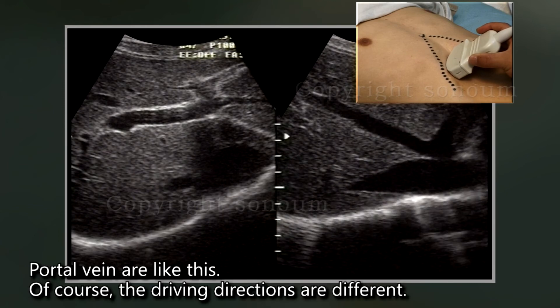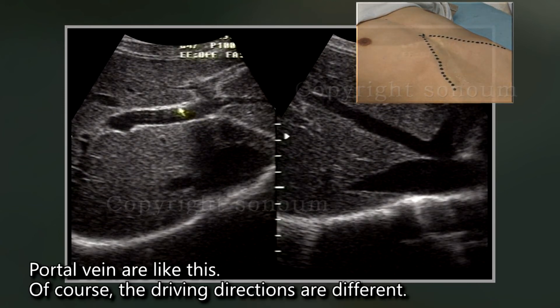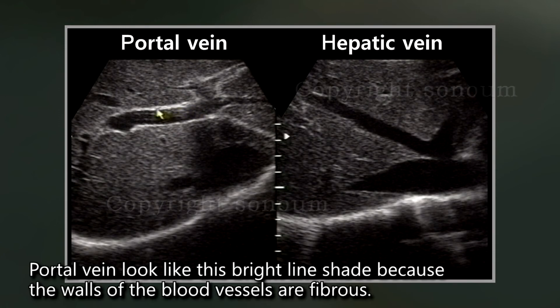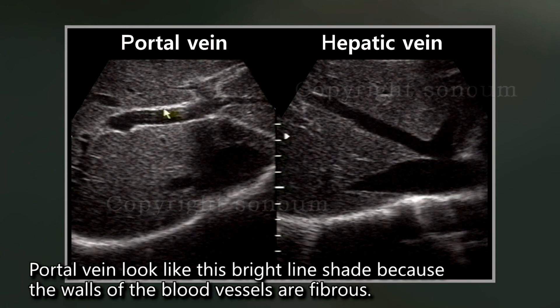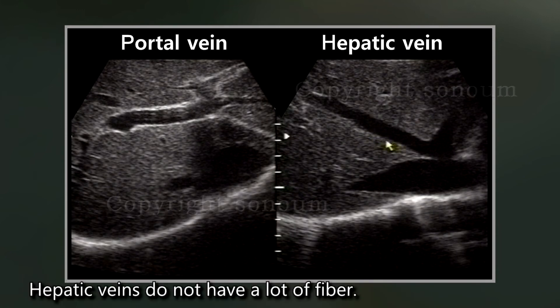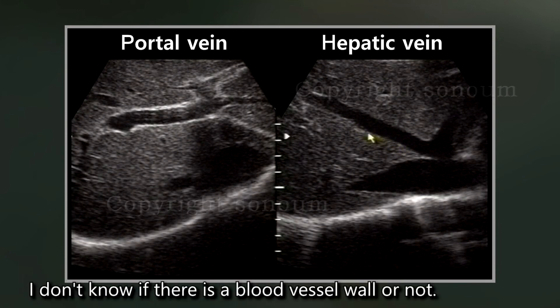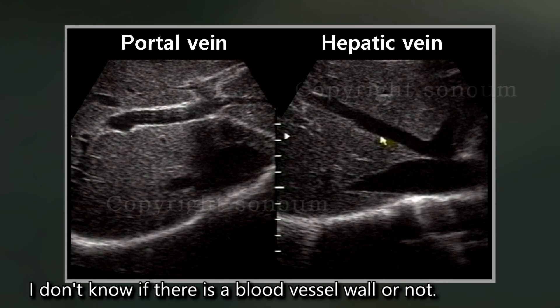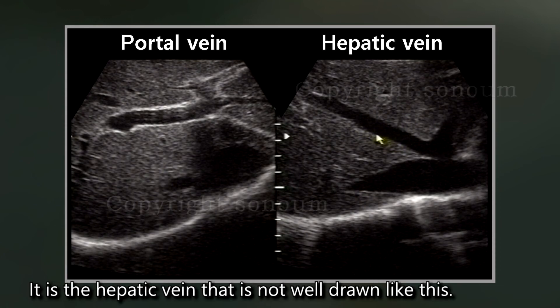Portal veins look like this bright line shade because the walls of the blood vessels are fibrous, and of course the running directions are different. Hepatic veins do not have a lot of fiber — you cannot tell if there is a blood vessel wall or not. It is the hepatic vein that is not well-drawn like this. This is how you should know.